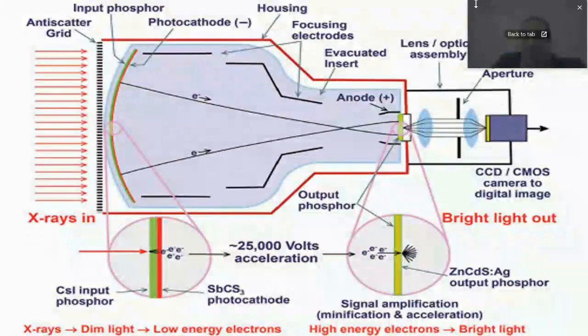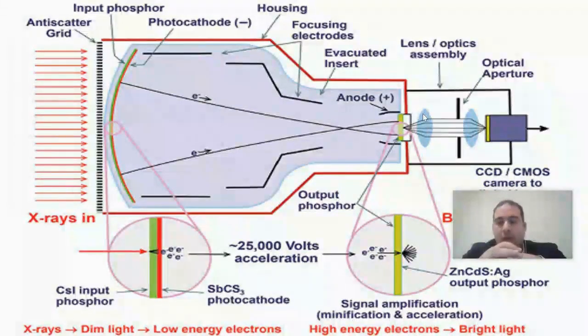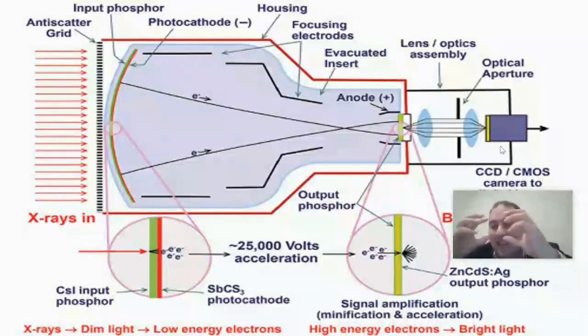What is the optical system or the optical lens system? It consists of two lenses. These lenses have properties that refract light, meaning the light that hits them is refracted at a certain angle. As we can see, it travels in this path from this focal point and gets refracted in this way. When it refracts like this and starts to move in straight lines, it encounters another lens that redirects it back to its original position. So, what is this part? This is the part of the camera. The camera tube receives this signal and displays it on the screen.